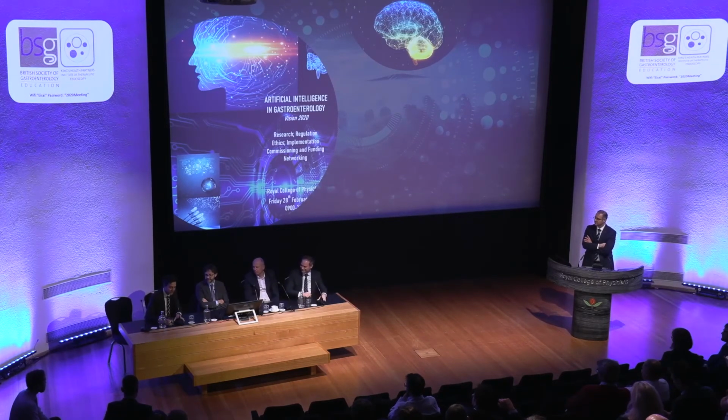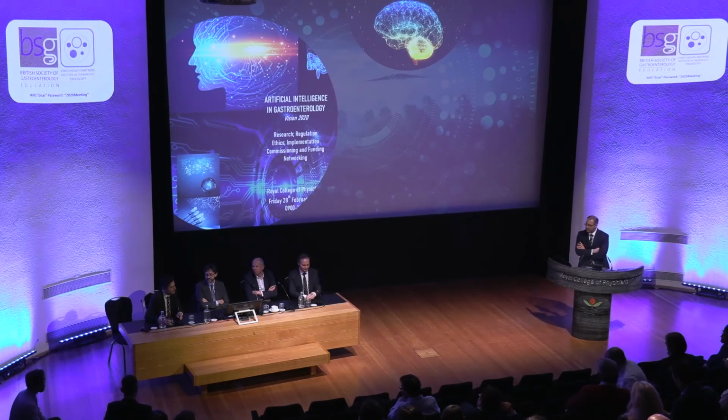Well, I think that's a really good question. I think often when you evaluate polyps, people that know in our practice, we spend a long time looking at these polyps. 10 minutes or so is not an unusual time for a complex polyp. And more to take off when you found more. Sorry, say again? There'll be more lesions to take off when you find more with the beep.